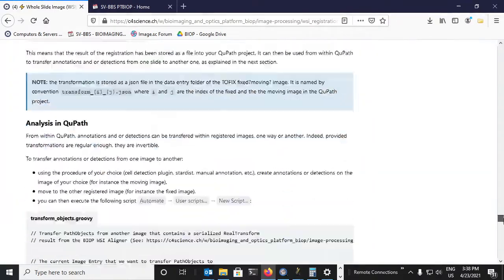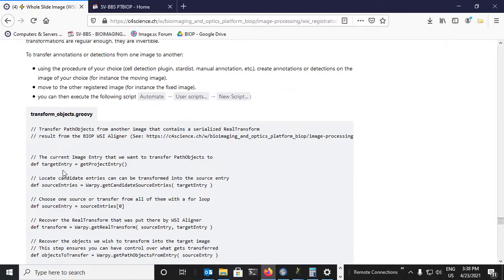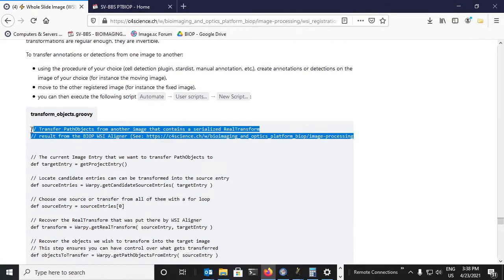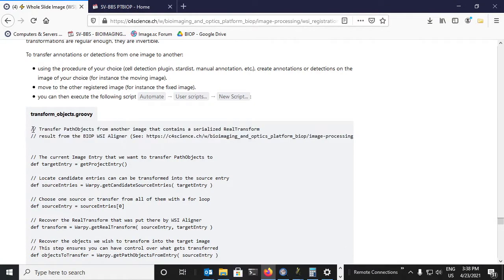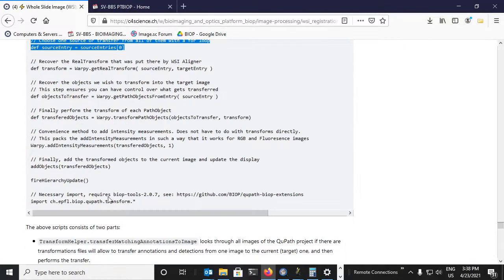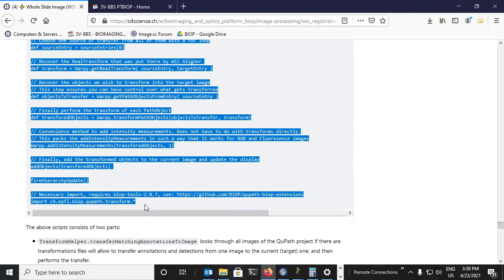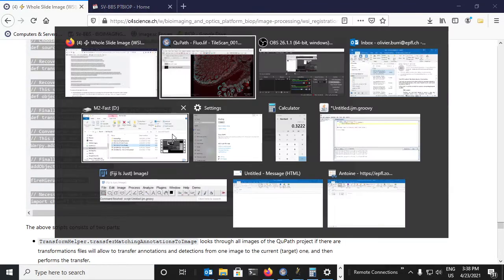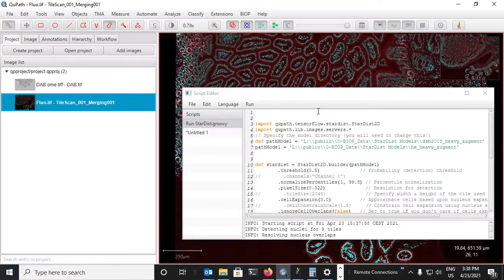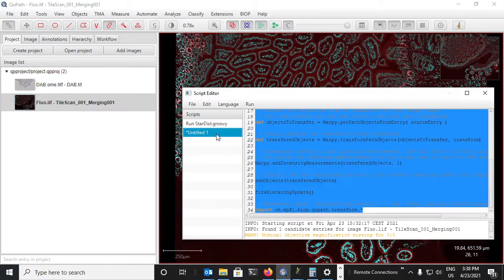And now all the way at the bottom of the page, there is the script that we can use to transfer the objects. So we're going to copy this to QuPath and I'm going to make it into a new script here.